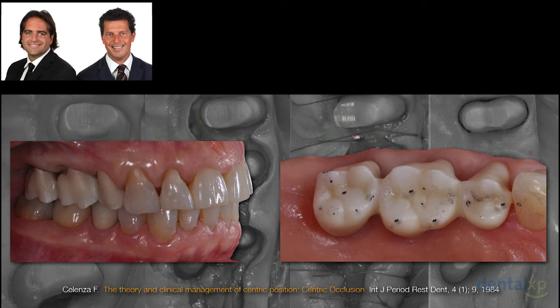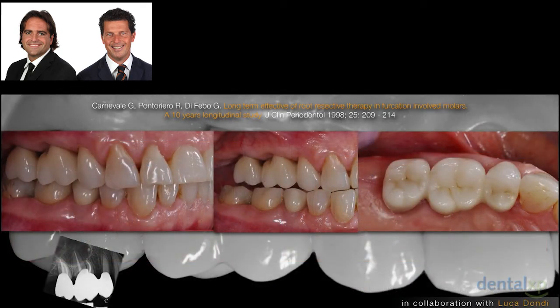It is exactly in cases such as this one where the digital solution allows great benefits in terms of time consumption during the clinical and technical workflow. Now we can deliver the final restoration in a complex case like this with only one try-in, the try-in of the hybrid translucent monolithic zirconia. And here the final restoration in place with the checking of the occlusal dynamics.